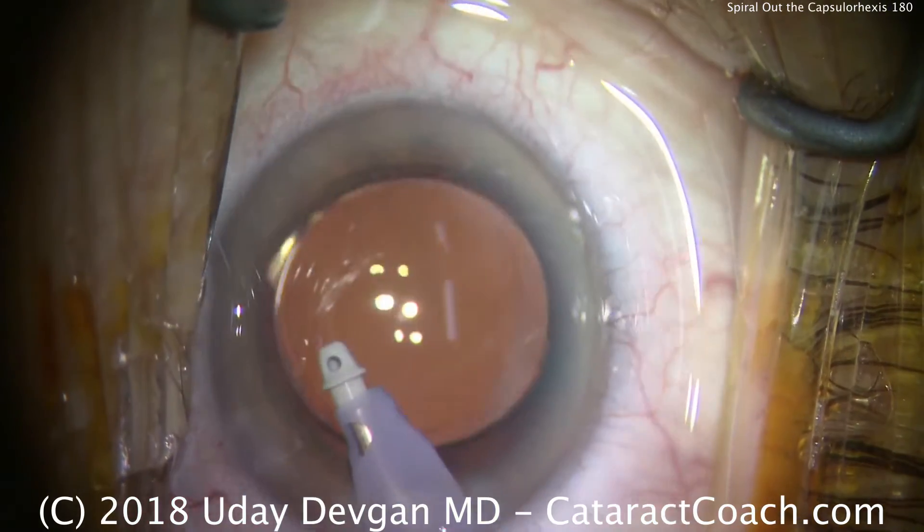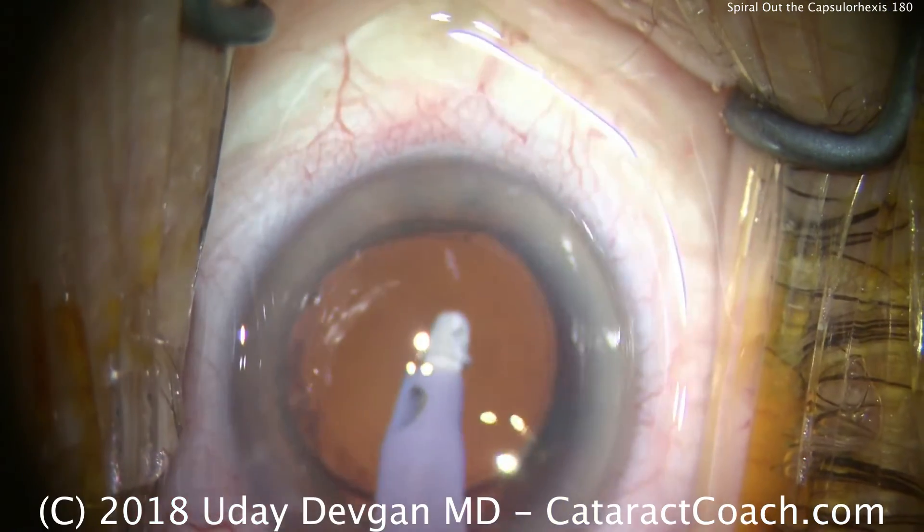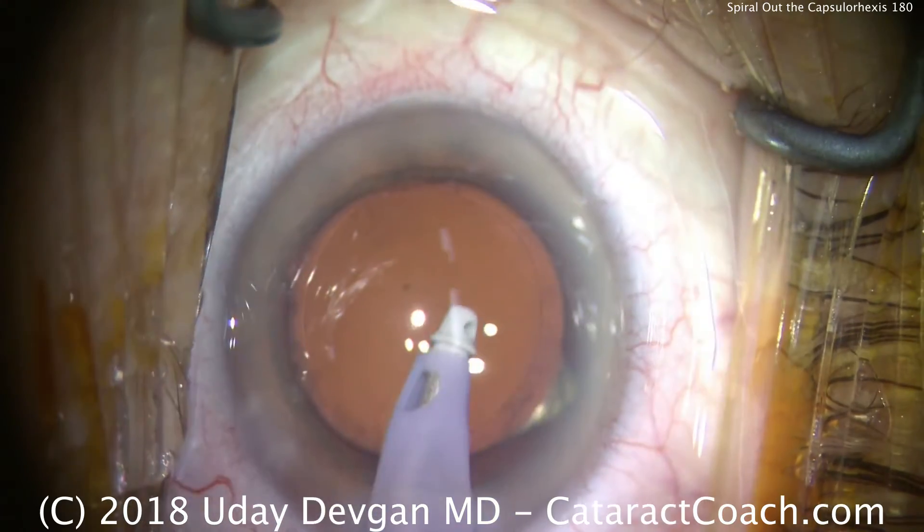Here we are at the end of the case showing that there's the overlap of the rexis on top of the optic, so it turned out to be exactly what we wanted.